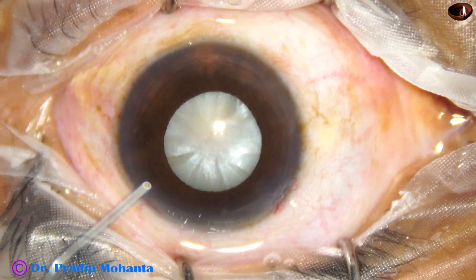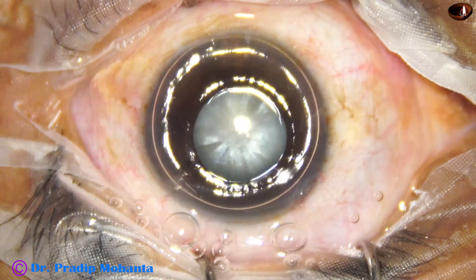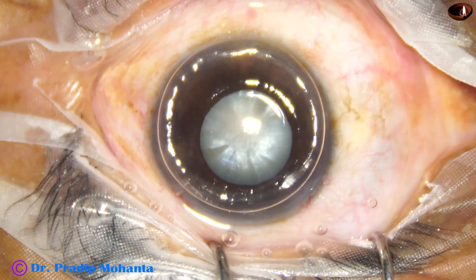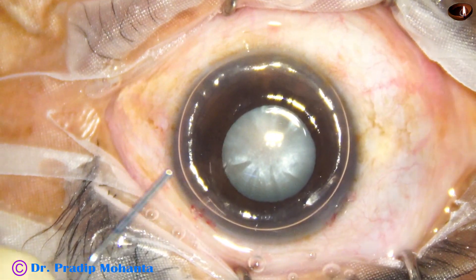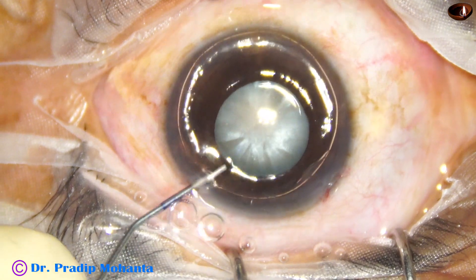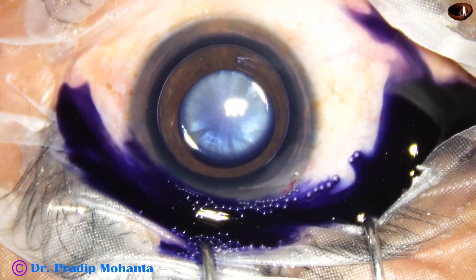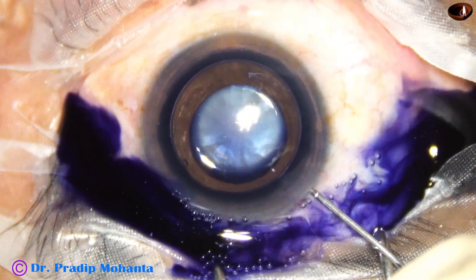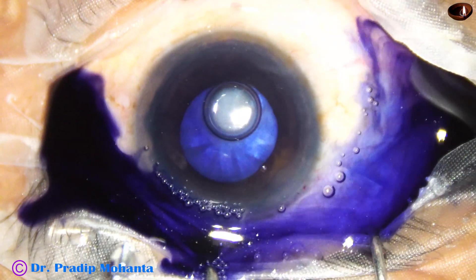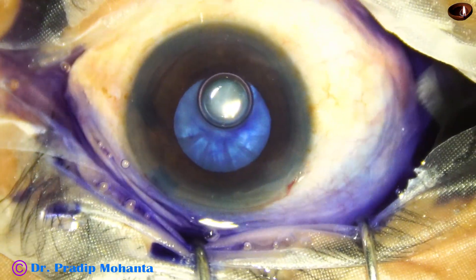This is an intumescent cataract, and I know that the pupil is going to be small during emulsification of the pieces. Trypan blue goes in underneath an air bubble. The staining is very quick because the dye is not diluted and it sits on the anterior capsule when an air bubble is used.